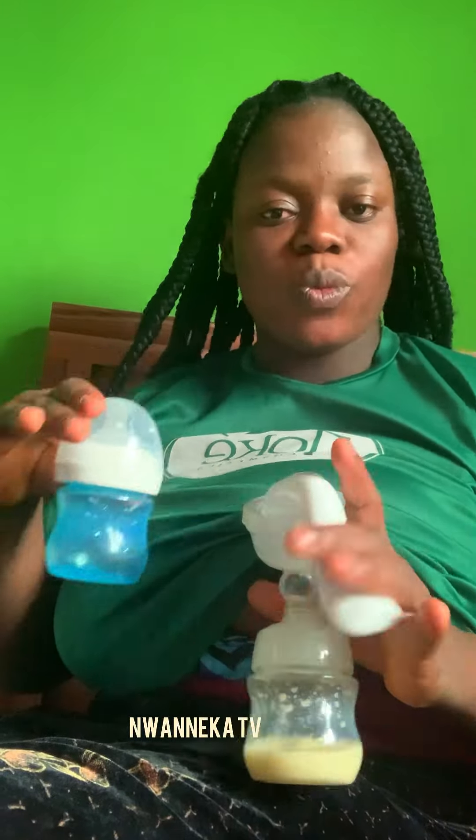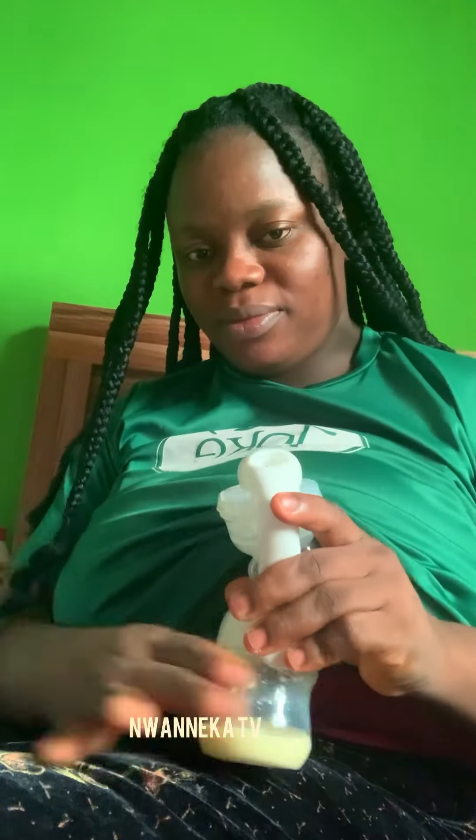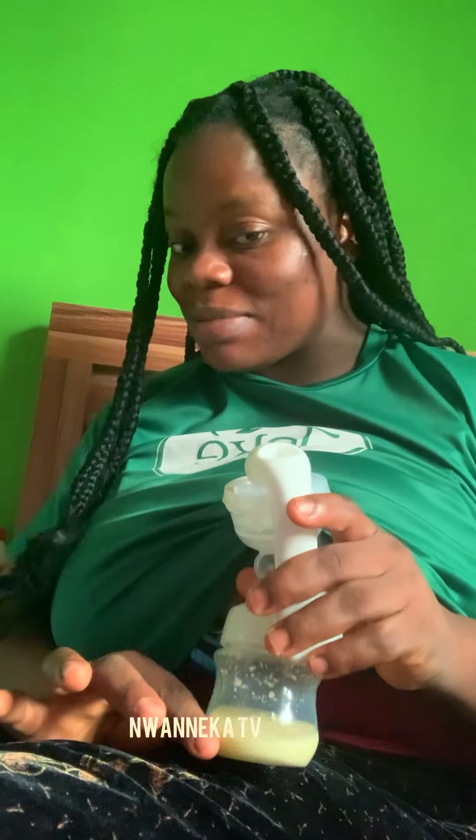Let's try and see the amount we're going to produce — let's wait and see. I think you can see it's dropping. So I'm done. This is what I can produce in 30 minutes — do you see? Because my baby has been sucking directly, I won't be producing as much.